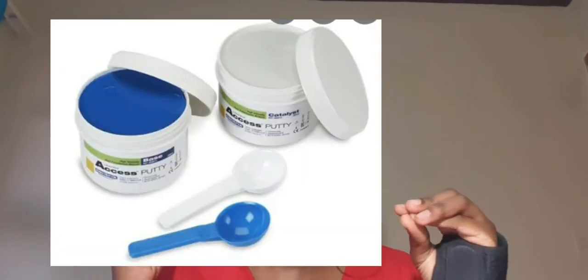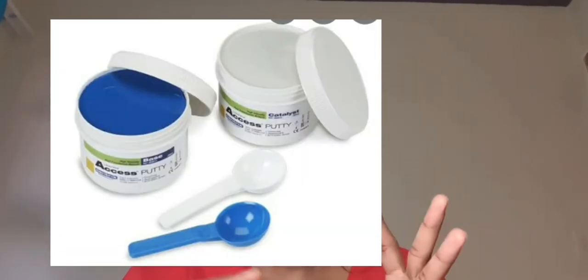And then guys, since I was talking about the putty form now, I need to remind you as dental assistants, this is very important. When you're mixing the base and the catalyst of silicones, you're going to take, let's say, 1 scoop of the base, 1 scoop of the catalyst. When you mix them together, please mix them without the gloves. Do not put gloves on, otherwise you're going to affect the setting as well as the reaction of the material.